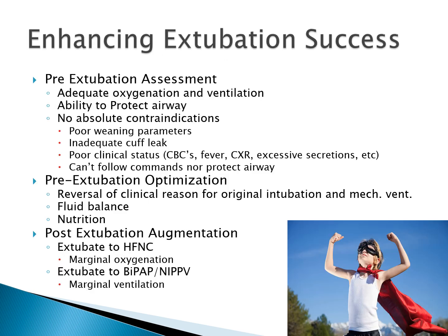So in terms of attempting to position the patient, not physically position them, but clinically position them for the greatest chance of success, so enhancing extubation success chances. Pre-extubation assessment: adequate oxygenation and ventilation, assessing their ability to protect their airway, no absolute contraindications that we've discussed previously. Pre-extubation optimization: reversal of the clinical reason why they're intubated, fluid balance, nutrition. Post-extubation augmentation: again, if it's a marginal case, having the non-invasive ventilation device ready.